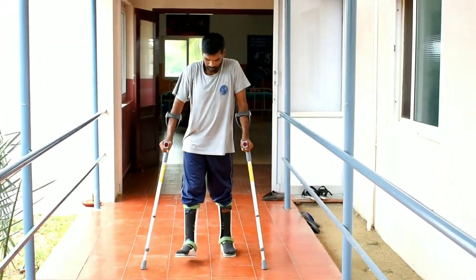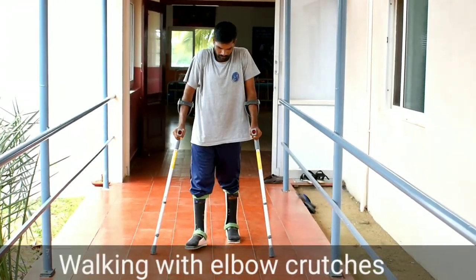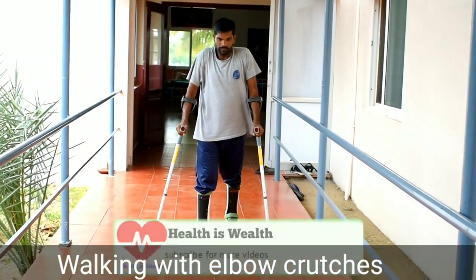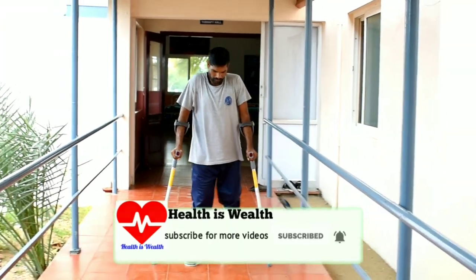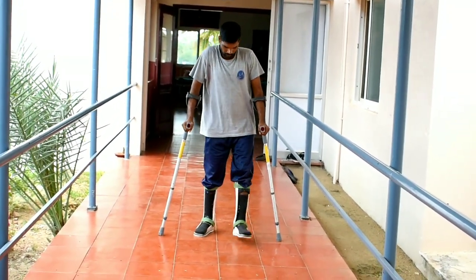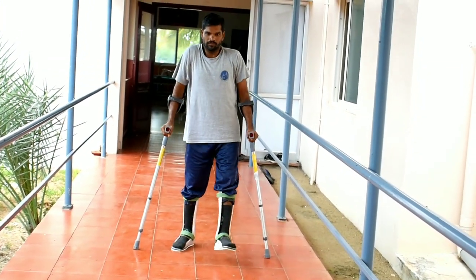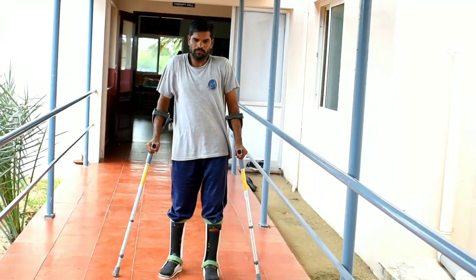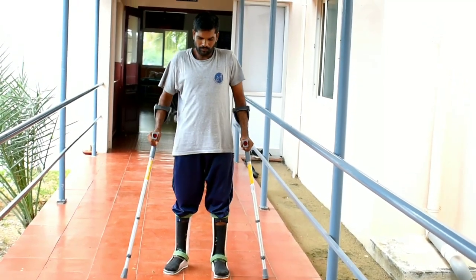This is a complete paraplegia patient who used to walk with KFOs and a walker. Now he has improved power in his lower limbs, so we initiated walking him with elbow crutches and bilateral AFOs. We planned to teach him one side bar and one elbow crutch, and once he gained endurance and balance, we progressed towards bilateral elbow crutches.